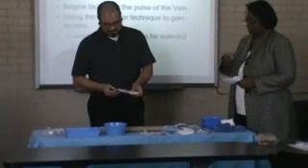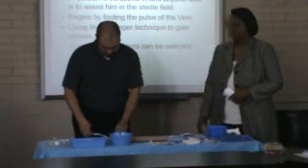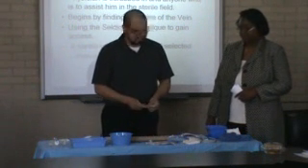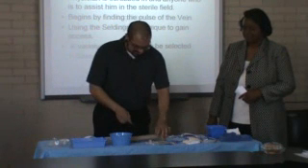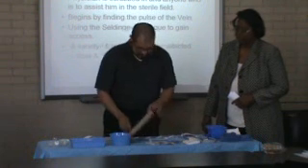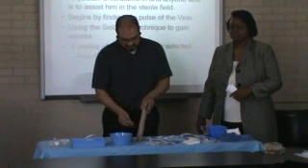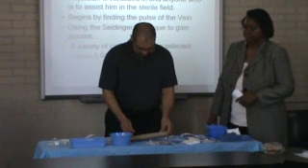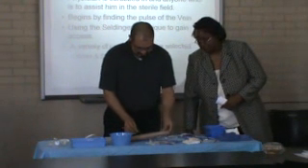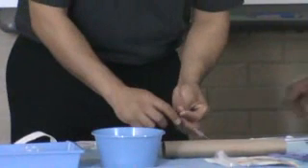Okay, so you would take the needle. He would want to go into it at an angle. He wouldn't want to puncture straight through because that'd be pointless. So we'll go in at an angle. And once that's in, he uses a small access wire, a J wire.